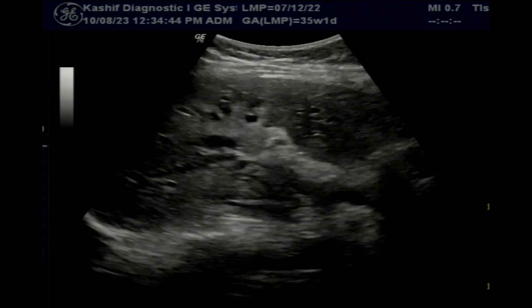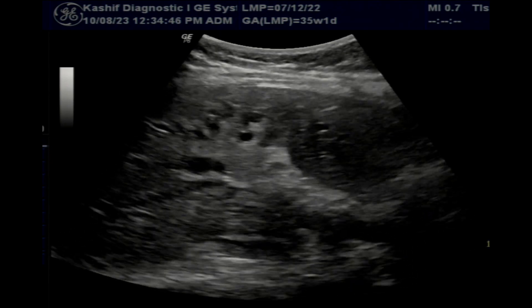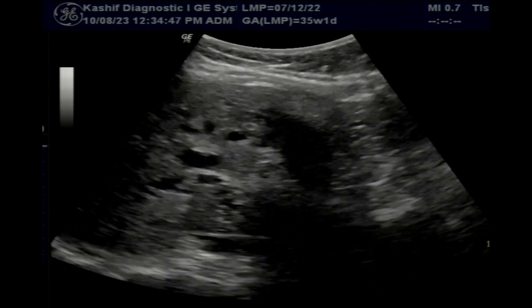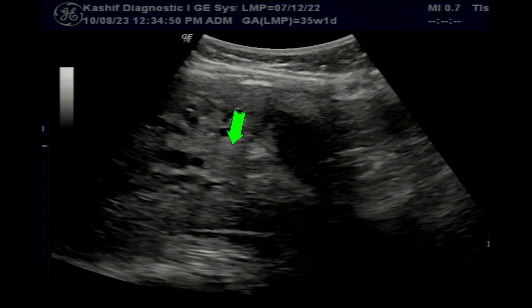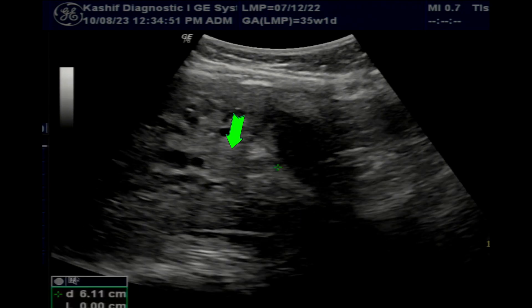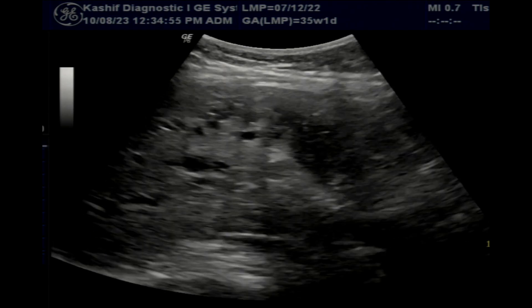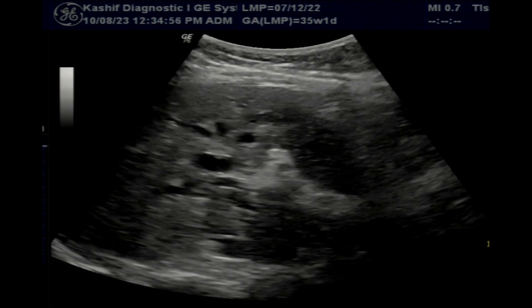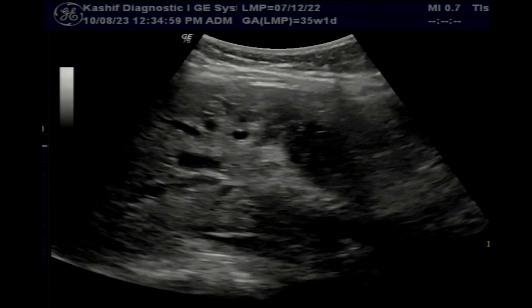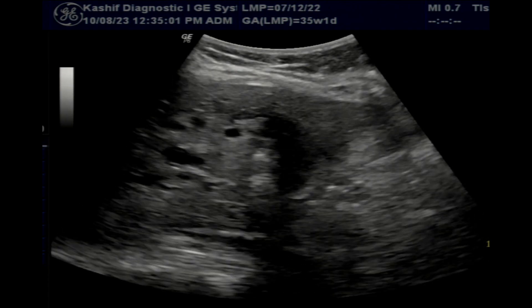Since the CBD is not dilated, the obstruction is at a level above the CBD. When we closely visualize, we can see a small isoechoic, poorly differentiated mass extending into the bile duct and causing the obstruction. There are no dilated bile ducts below this level.